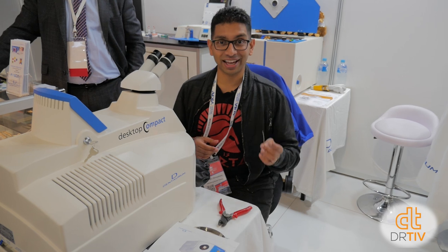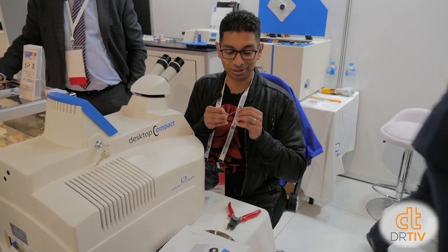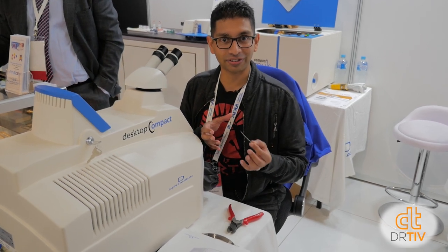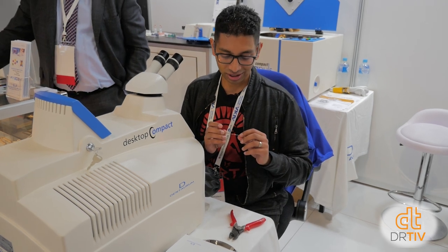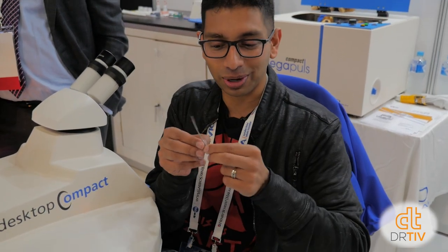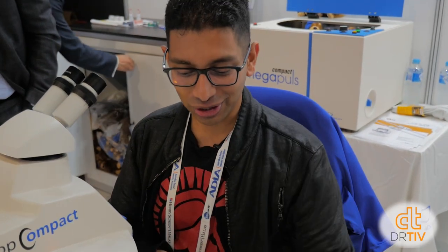I'm sitting in front of a desktop laser welder — this is from Dentaurum and it's called the Desktop Compact. This thing is $27,995. You can weld bits of metal together, which is pretty cool. It's not for adding brackets onto bands — that's your spot welder — but this is for putting broken clasps back onto dentures and things like that. First time I've ever laser welded something, it's really easy. I welded two bits of wire together and I can't break them apart. Pretty impressive.